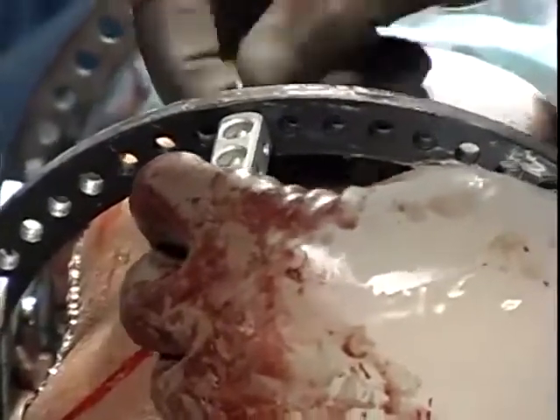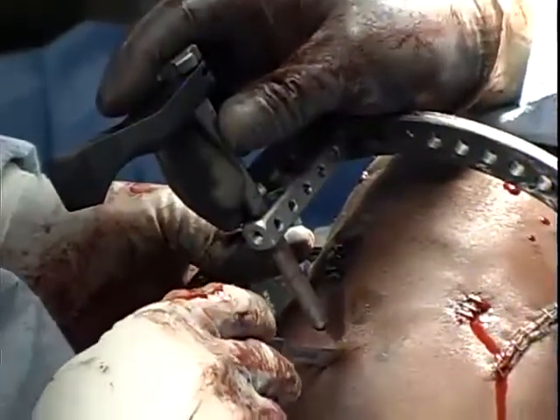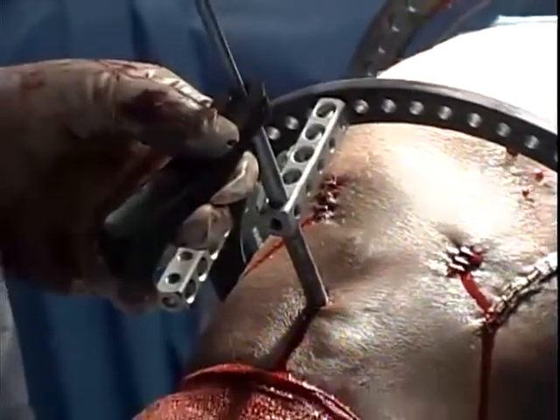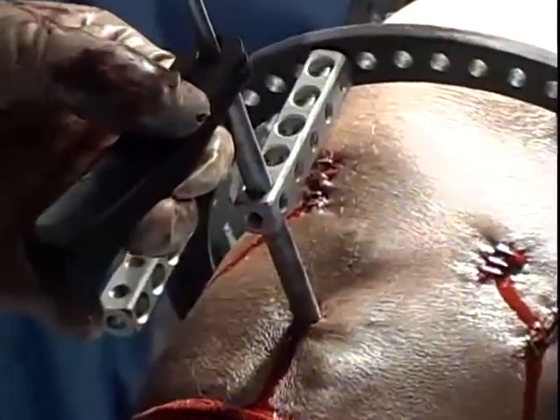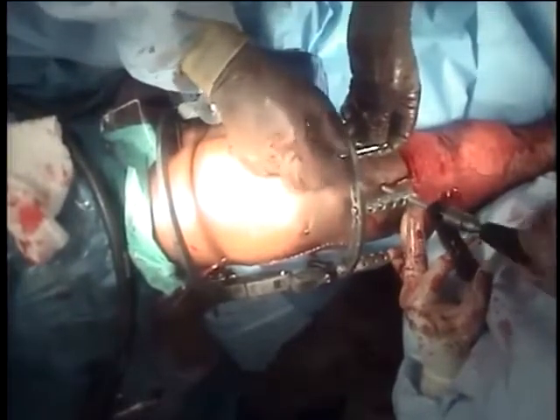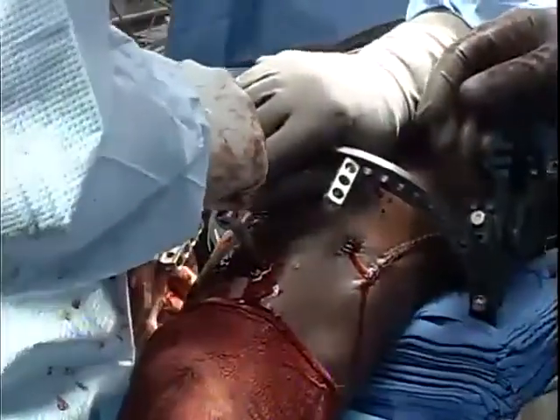Place three Rancho cubes onto the tibial ring: one nearly straight anterior, a second four or five holes over medially, and a third as close to 90 degrees off as possible on the anterolateral side. For the first pin, feel down to bone, dimple the skin, make an incision, pass the triple trocar to tibia, remove the center, and insert the 5-millimeter tibial drill bit. Drill anterior to posterior to the far cortex, stop, measure, add 5 millimeters, drill through the far cortex, place the first pin, remove the quick chuck and centering sleeve. It's important that all three tibial pins be different lengths so they don't intersect within the tibia.